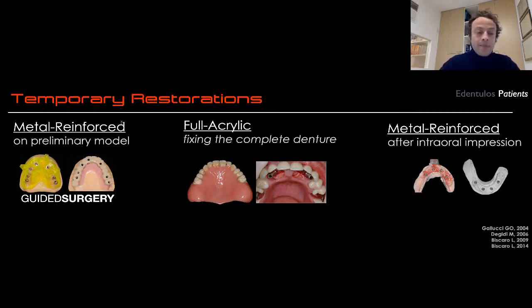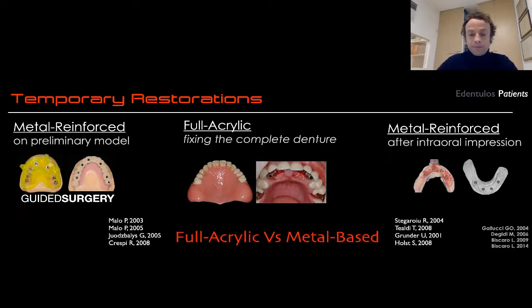So these are my two different approaches. The first one is mainly considered when we have to also place implants immediately. So we have to extract the teeth and place the implants immediately, and we use this approach in particular when we have the chance to create a dental bridge. And so I want to immediately create a good temporary restoration that can support the soft tissue in the perfect position where it is, in order to reduce the recession as much as possible. But in all the other situations, in my opinion, this approach is the most predictable and the most simple to do.